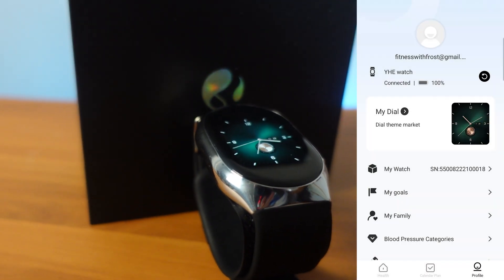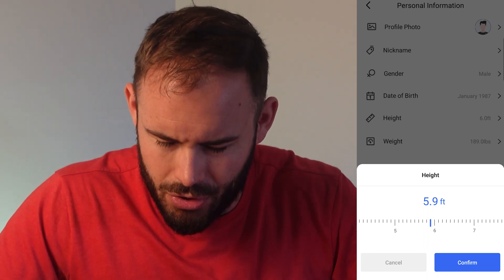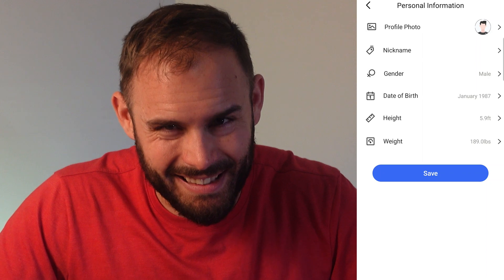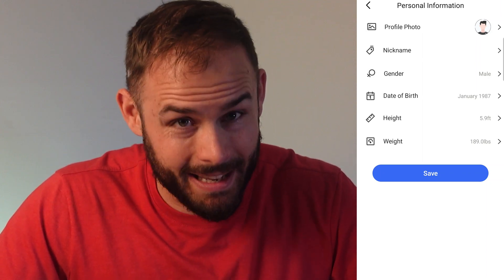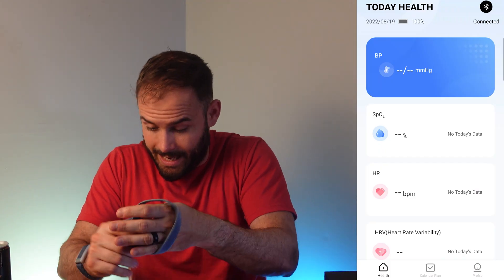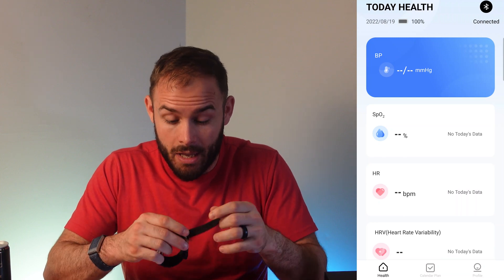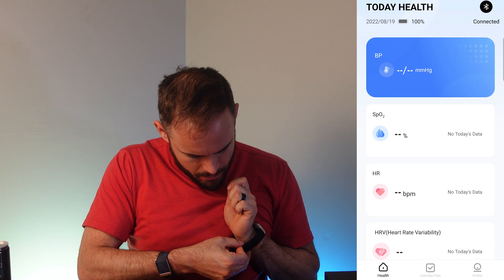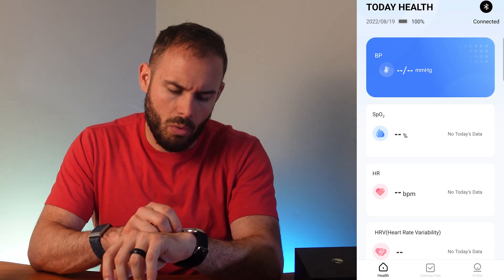Looking at the profile, it shows 5.9 feet — should probably say five feet ten inches. The watch is a hefty device, pretty heavy but very nice with its clasp. Let's see how it fits on the wrist. It is relatively big, but we know why we're here — we're going to be checking out blood pressure.